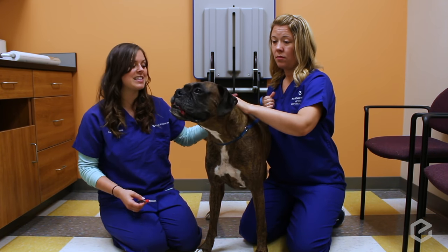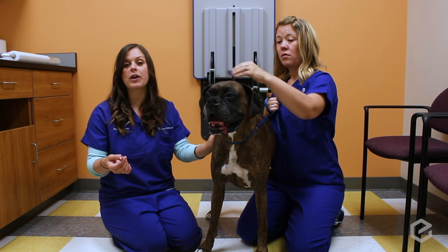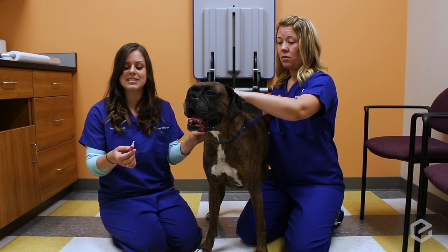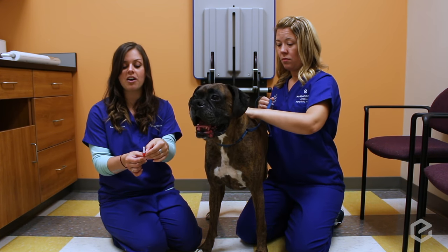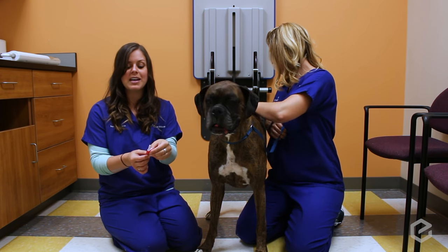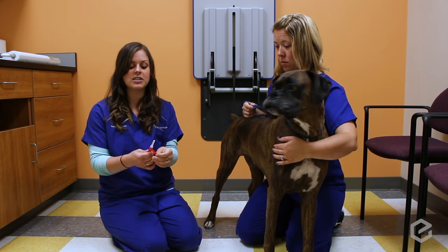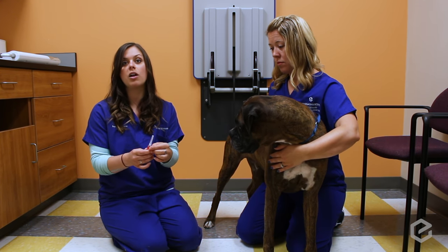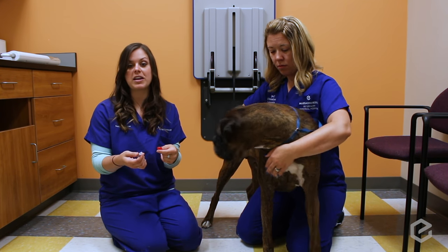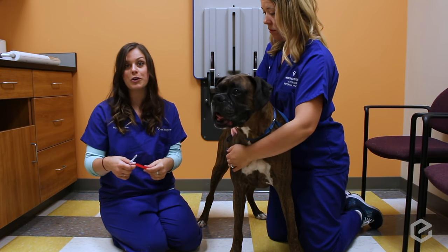Before you start anything, make sure that you have your syringe ready and that it's the right medication and the right dose. Take off the covering, because some medications are light sensitive and are wrapped with vet wrap. Make sure that the dosage in your syringe matches the label on the bag or package that the injections are coming in. Once you do that, you're all set to get ready to poke your pet.